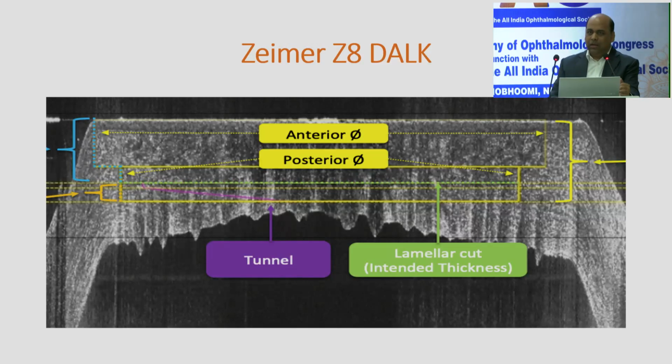As Dr. Sharon was supposed to present surgical management and DALK, I'll be starting from her talk. I frequently do femto-DALK in all my keratoconus cases. We have Ziemer's Z8 machine, which has a proprietary DALK software.